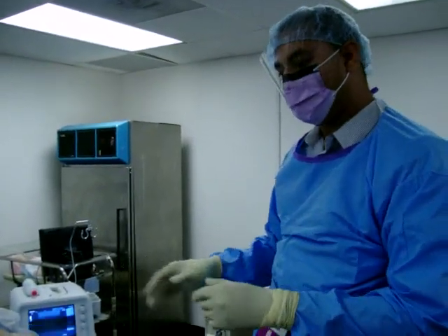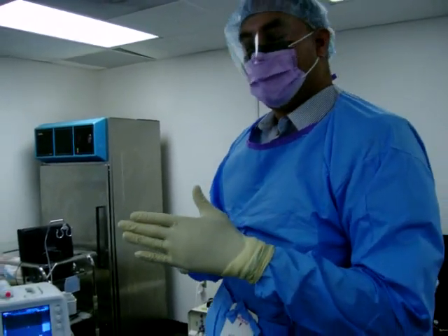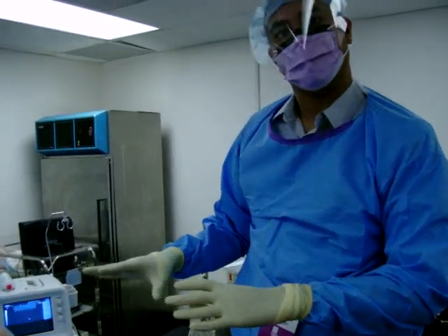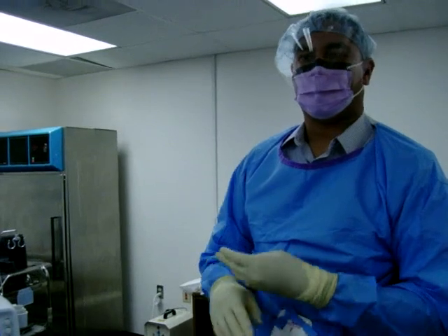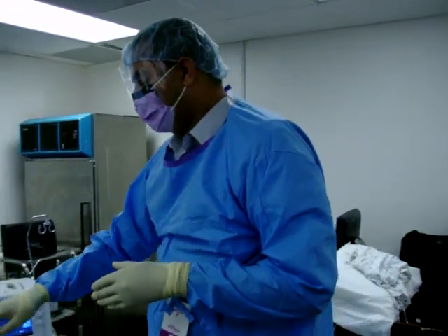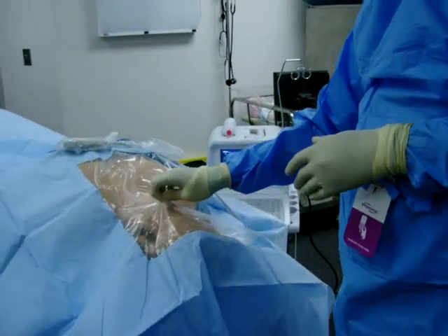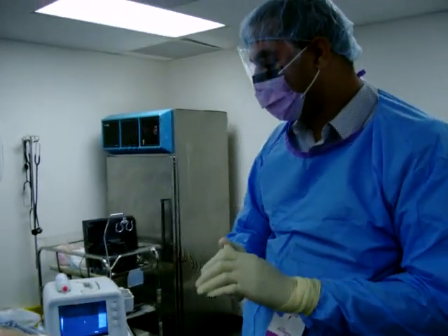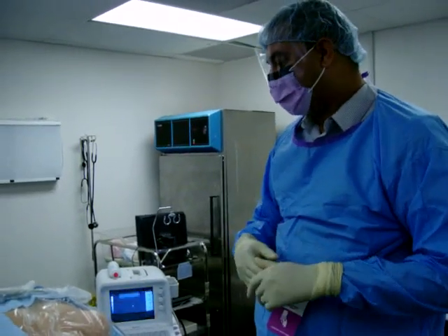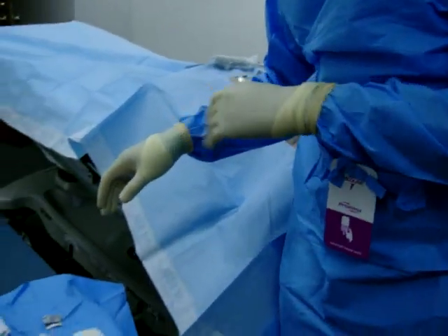Before the needle hits the skin — and I should have said this before I numbed it — you would of course do something called a time out. That would be before any sterile procedure when you're about to break the skin. You would call your nurse in, identify the patient, the site, the name of the procedure, and make sure you're doing it on the right side. You have to time out every time or else bad things can happen. If you end up doing a procedure on the wrong side incidentally, you're going to have a very difficult time getting a medical license. So the importance of the time out is paramount, and I really should have done that before I anesthetized the patient.